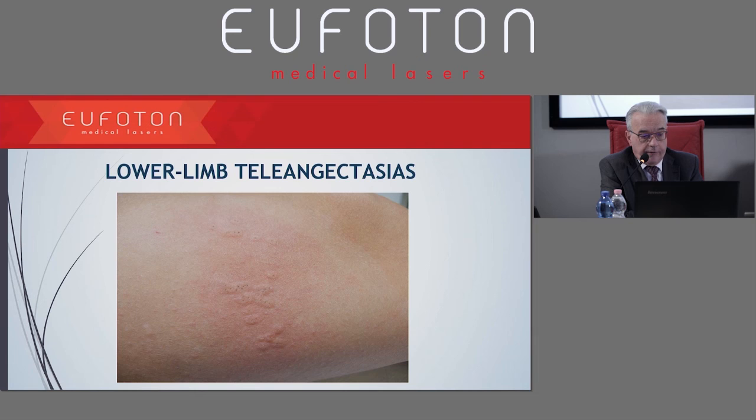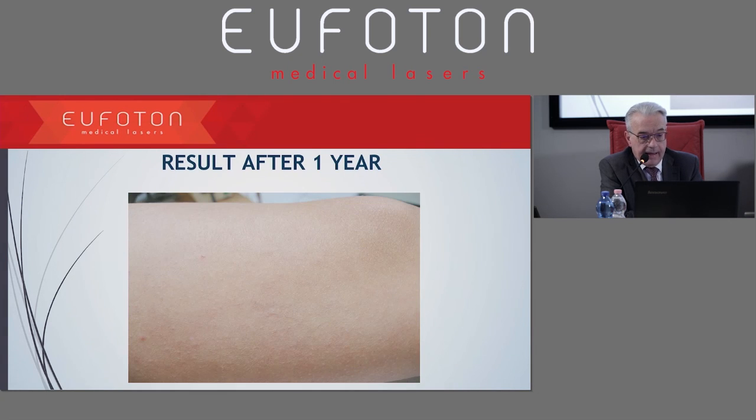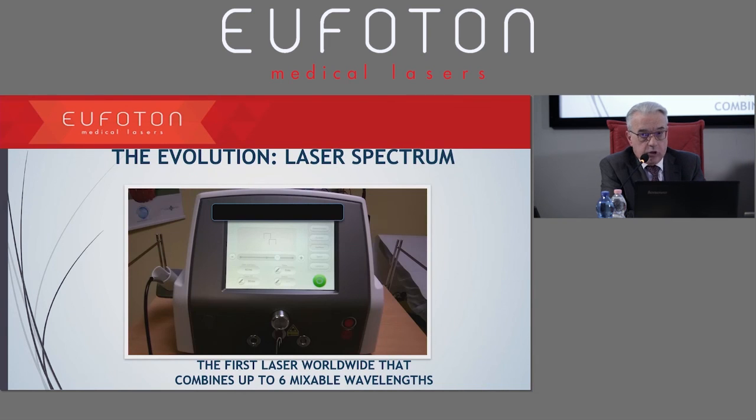The inner part of the knee, small telangiectasias, you see at the end of the treatment, there's a little bit of skin irritation that goes away after a bit of time, after 2 weeks and after a year. The evolution, we will have a specific presentation on this, so I just touch upon this briefly.